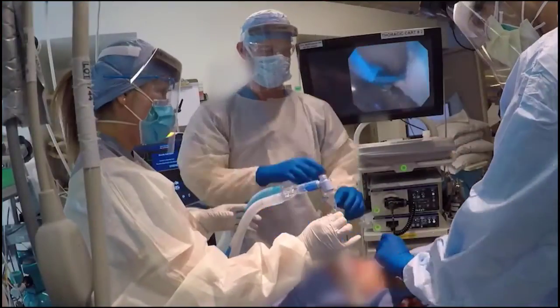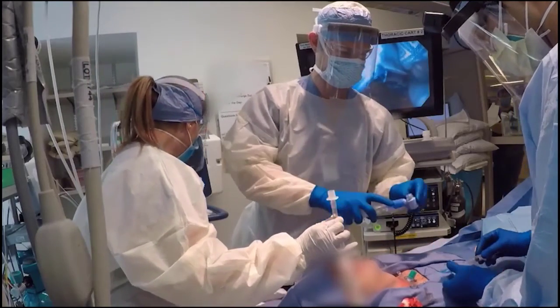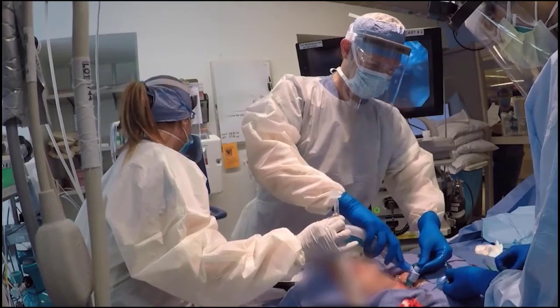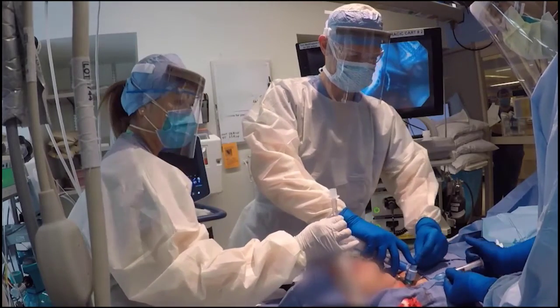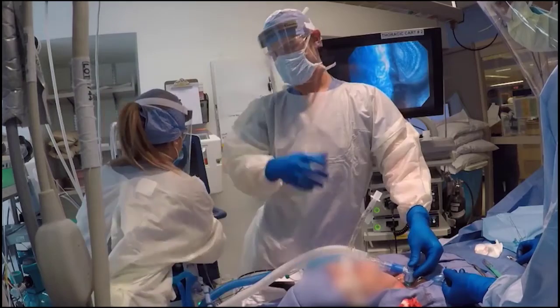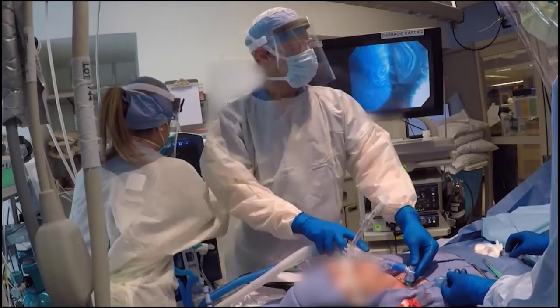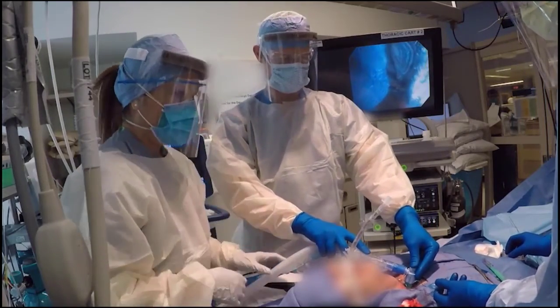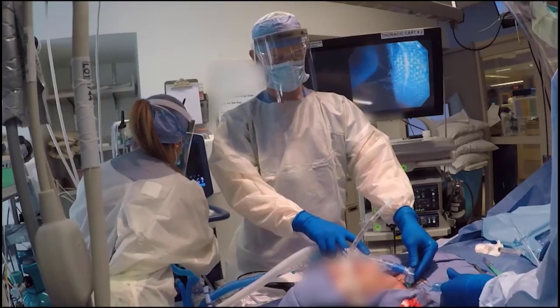Remove the protective sheath, wire, and trocar if used. Inflate the tracheostomy cuff, connect the circuit to the tracheostomy tube, and resume ventilation. The presence of end-tidal carbon dioxide confirms placement in the airway. Alternatively, the bronchoscope can be reinserted through the tracheostomy tube to visually confirm placement within the airway.